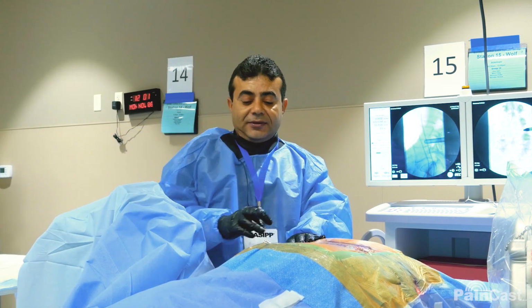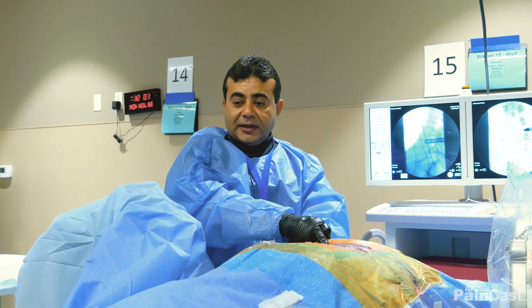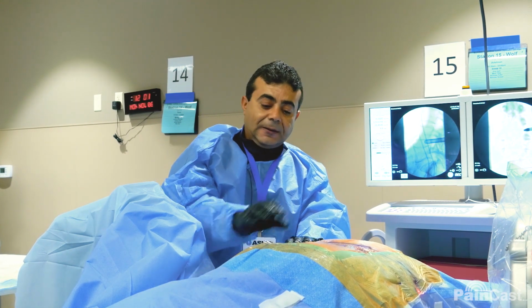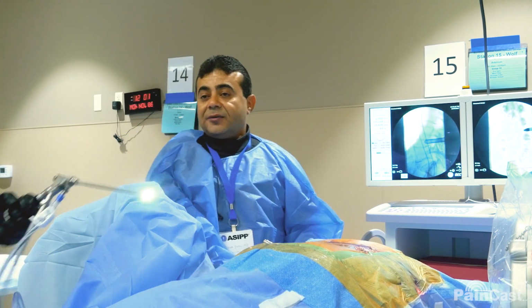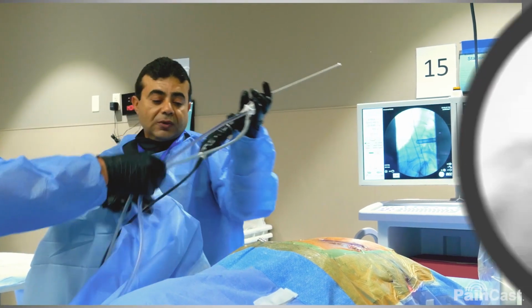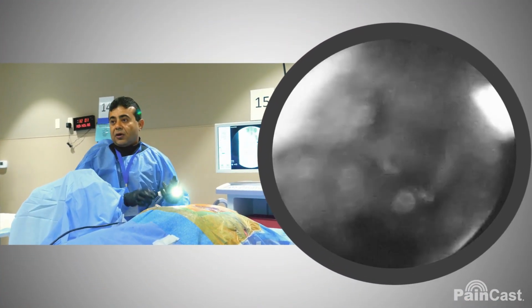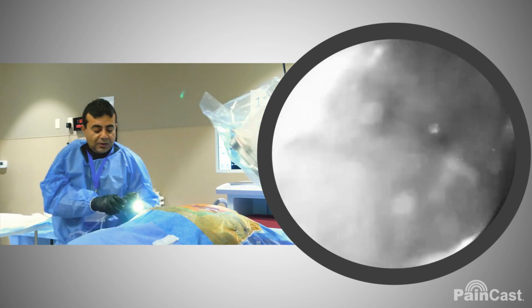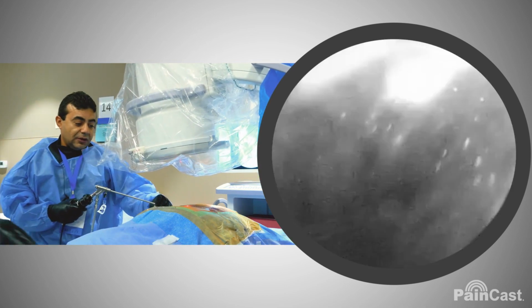Now we have a sheath going from outside all the way to the inside of the disc. We're going to check lateral view, that's what we have, and then we're going to go in AP view. Always plan your entrance, or plan where you're going to do your work, according to the MRI. Your MRI is going to show where your herniation is, and that's your target, and that's what you're going after.